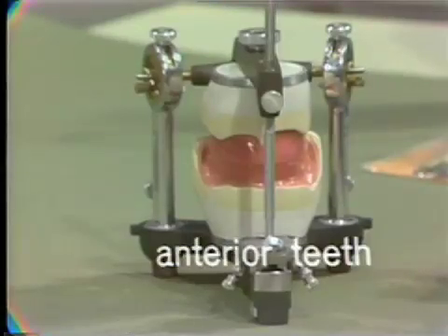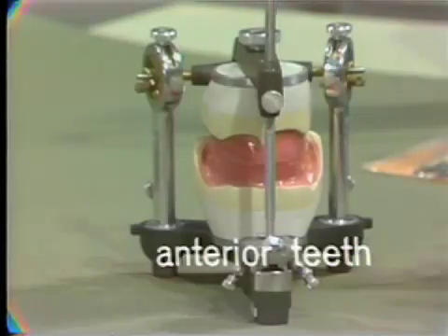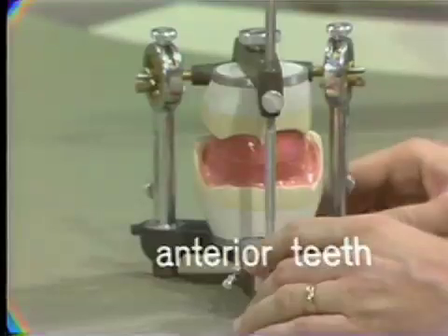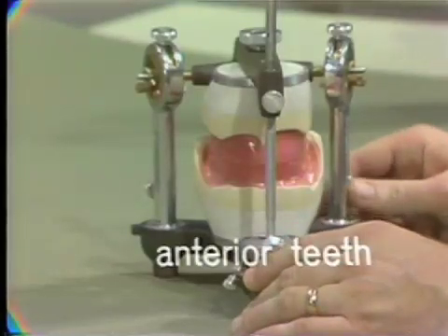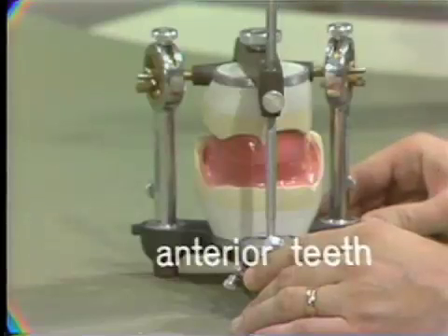After we have recorded and registered the patient's intermaxillary relationships, we transfer these relationships to the articulator and then develop our wax occlusal rims in the manner described in the last exercise. We are now ready to set the denture teeth. And we start, of course, logically, with the anterior denture teeth.